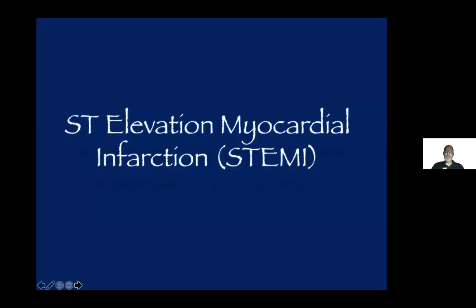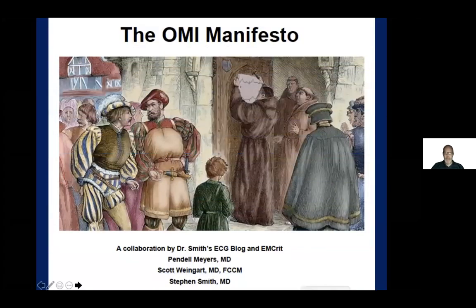I just told you that STEMI is not the best term to use, so why are you looking at it on the slide? Because I'm going to overlay it with this. I would encourage any paramedic who reads multi-lead EKGs to Google this document and download it. It's free, open access med education.